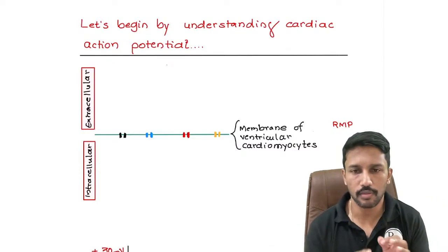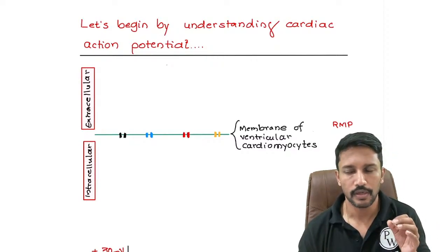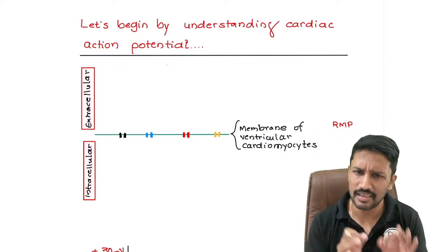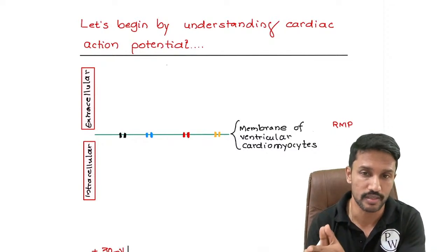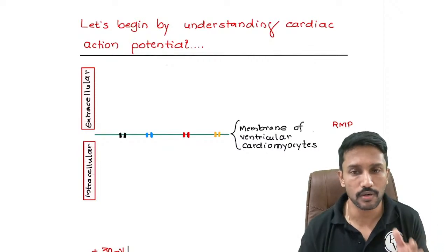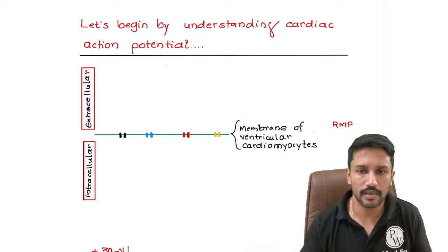So today we will be talking about the ECG changes in electrolyte abnormalities, and you all know that in the last 3 or 4 years, almost every NEET PG and FMGE exam had some ECG related to electrolyte abnormalities. So after MI, AV blocks and arrhythmias, the next most important ECG topic for exam-going students is going to be the ECG changes in electrolyte abnormalities.